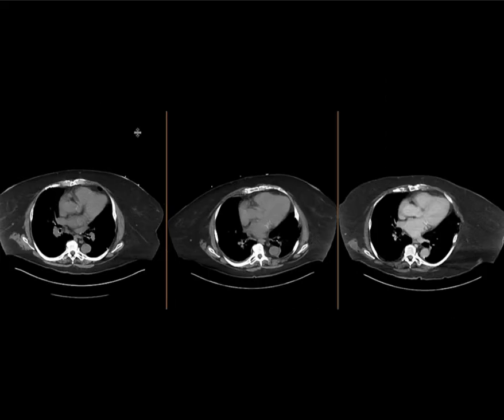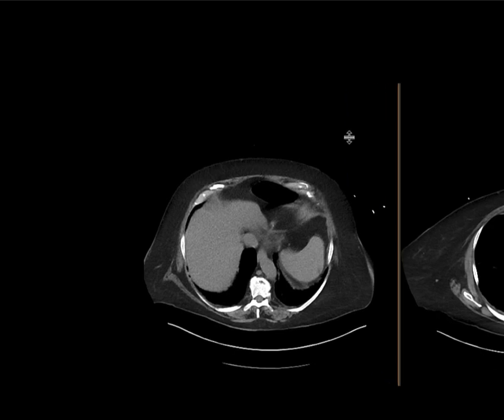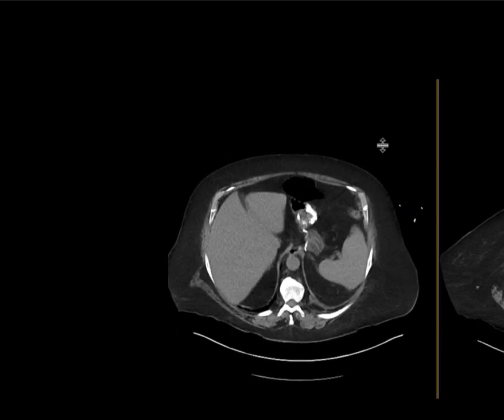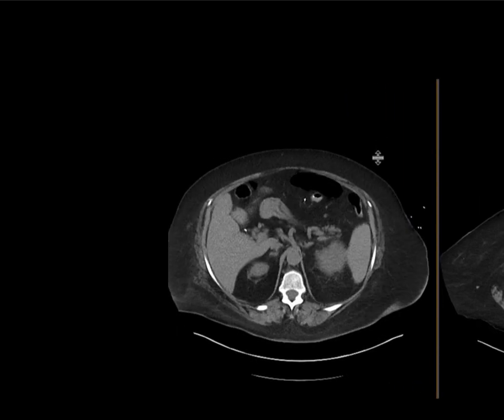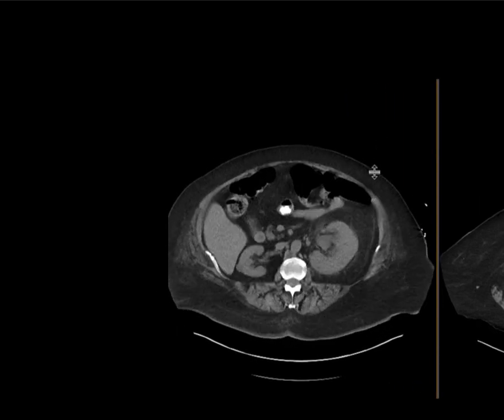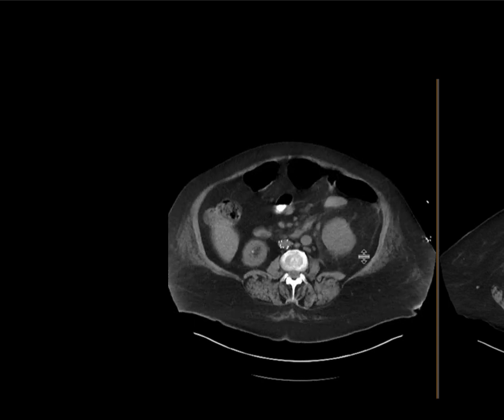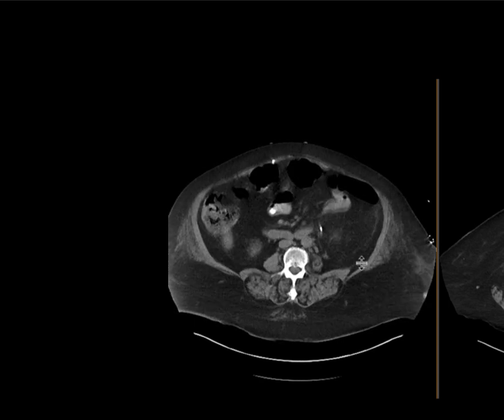Here we have a patient who came with left flank pain. On the initial non-contrast CT, the left kidney is asymmetrically enlarged and there's some hydronephrosis, which is upstream from a stone in the proximal ureter.